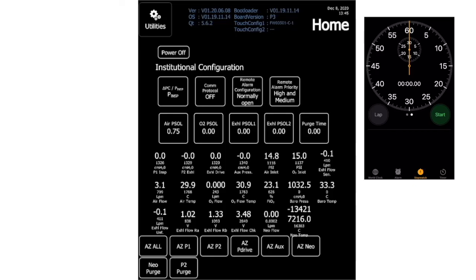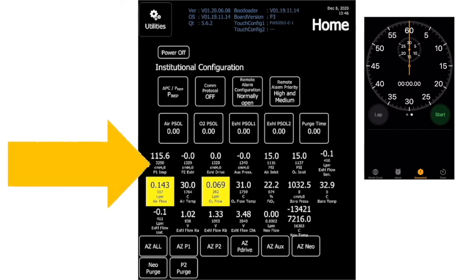I want to keep it occluded because I want to create a seal. So I'm looking at my P1 value. I only have pressure on P1. That's my inspiratory side. And it's 120. So it's way over. Now what I want to do is turn down my airflow, turn it all the way off while it's occluded, and let's see if it holds this pressure. I want it to hold above 90 centimeters of water for 10 seconds.